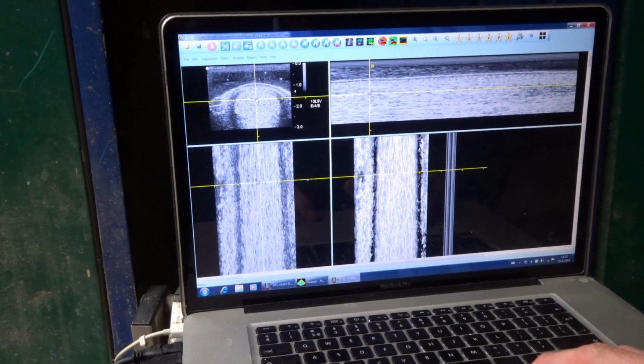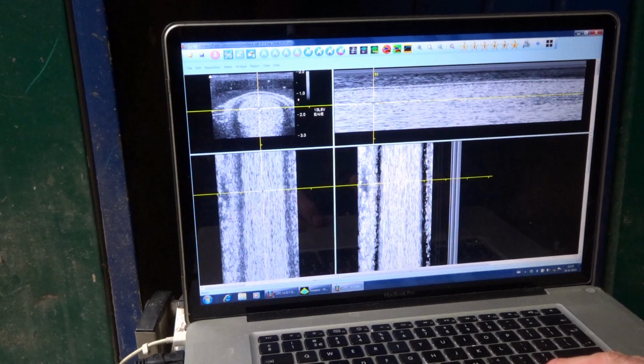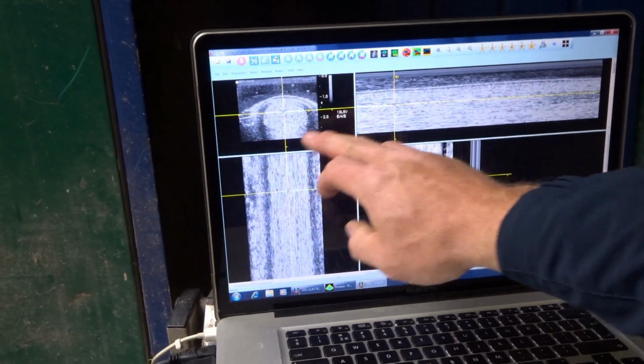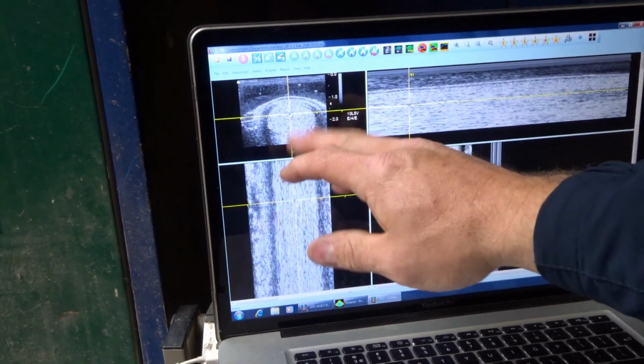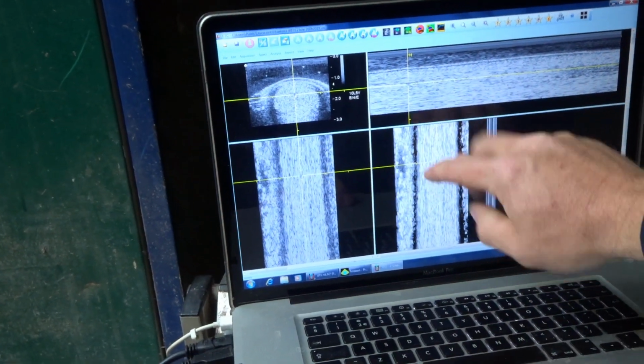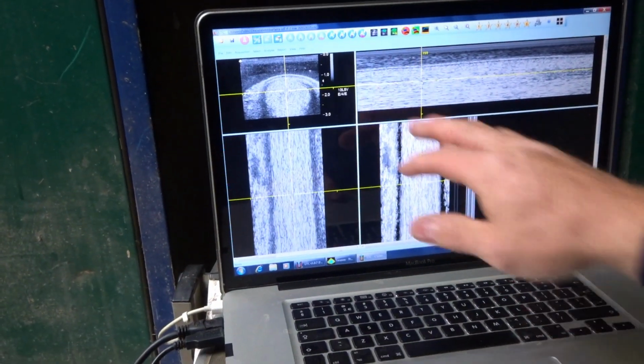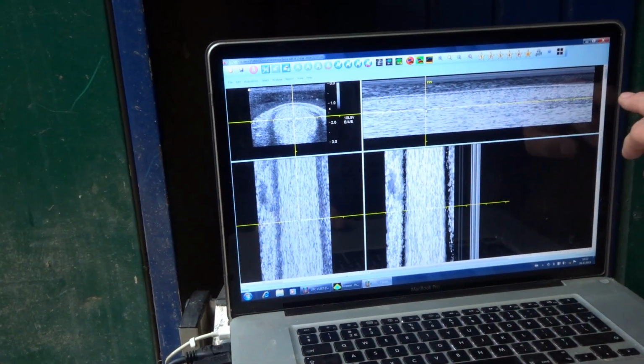Okay, so this is the image that we just made. The beauty of the technology is that we can actually scroll through the whole tendon. This is the image that you normally see in a traditional ultrasound. It combines the 3 images basically to a 3D image here. And what I always really enjoy is the fact that you can scroll through the tendon. So here's where the knee is, that's where the fetlock is.